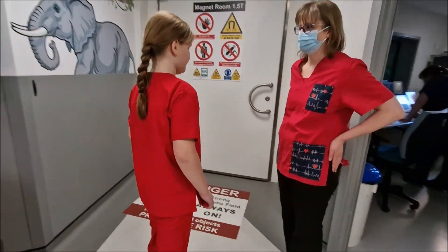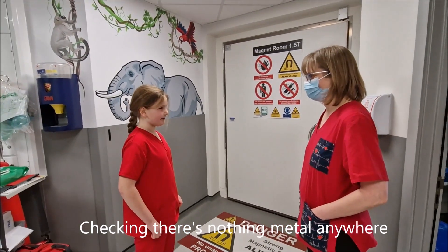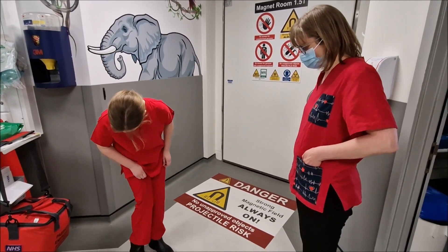We've got to check for metal. Do you remember why we need to check the metal? Anything metal can just fly into the magnet — so that's the dangerous bit about it — so we need to make sure all our pockets are empty.